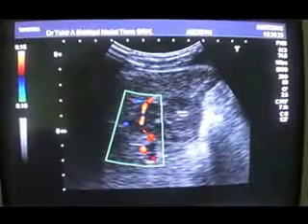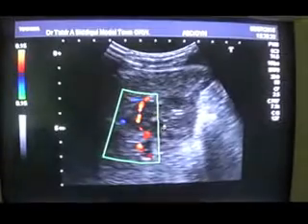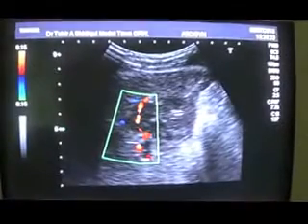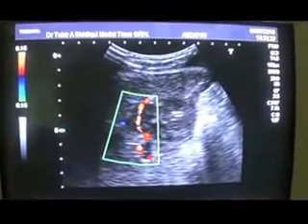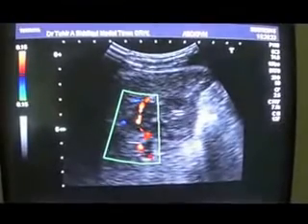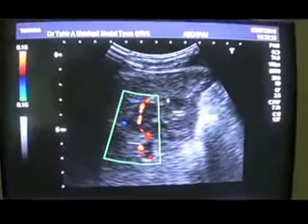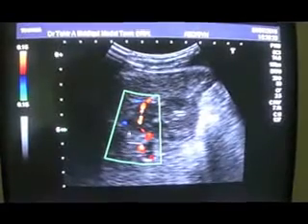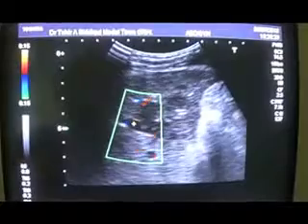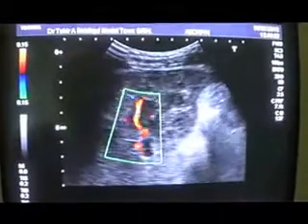Now you see the vessel is passing straight through this focal lesion, and had it been a solid mass, the vessel would have diverted around its margin from here or here, whereas we are seeing that the vessel is passing straight through it, so it is also a focal spared area in the anterior segment.